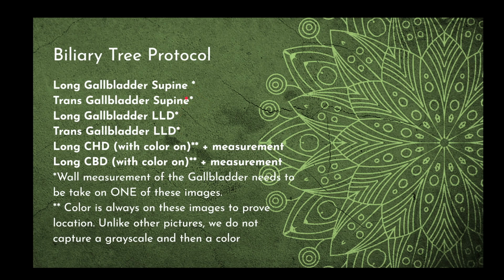Now the 4 of those are starred because you have the choice of these 4 to measure your gallbladder wall. You only need to measure the gallbladder wall on one of these images, and they'll go over this in lab with you.